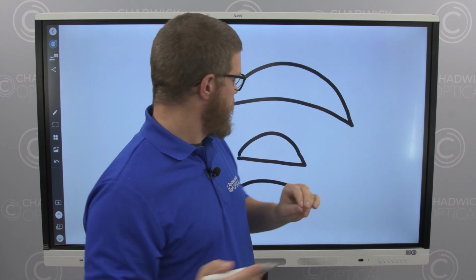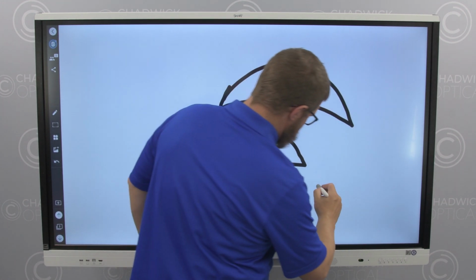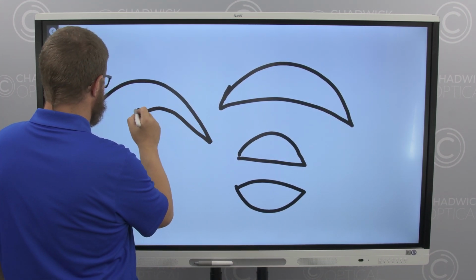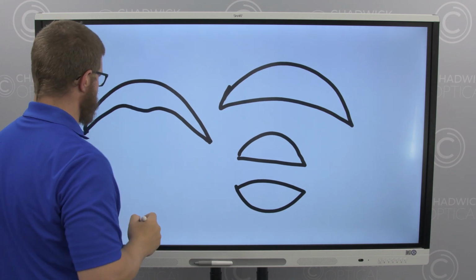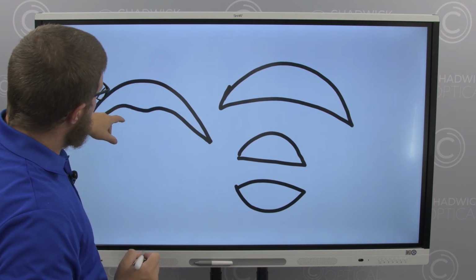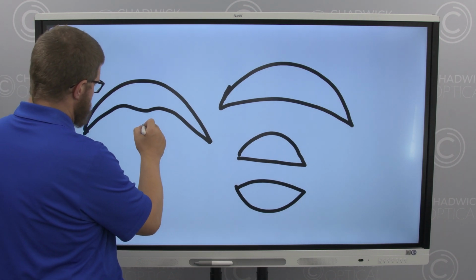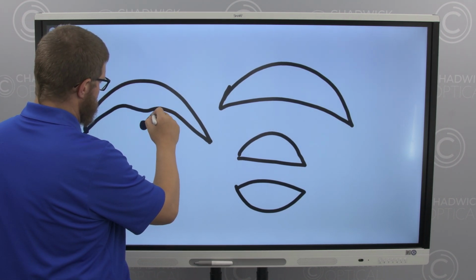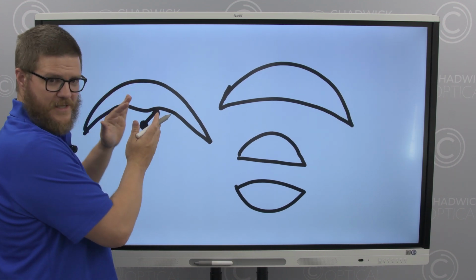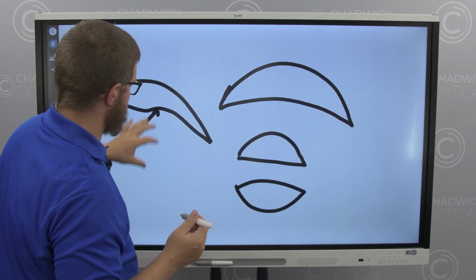Now, what can be kind of addictive, and we hear this a lot, is patients saying, I don't care, make it as thin as you possibly can. And when we make it like this, so you have the front lens, we do something like this, and it makes the lens, other than looking like a UFO or a seagull, reintroduce the oblique astigmatism, because here your eye is going opposite the angle of the lens and you can't see well through it.